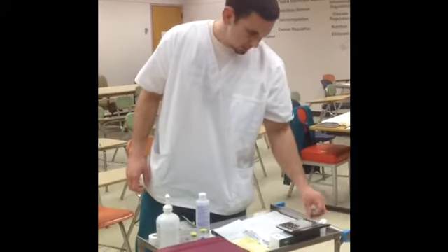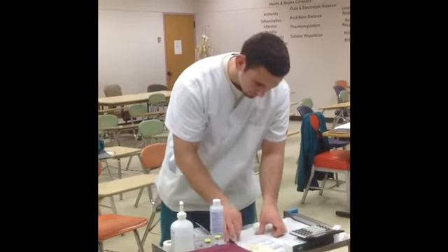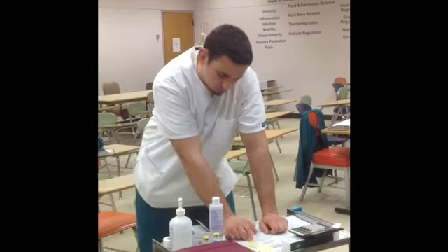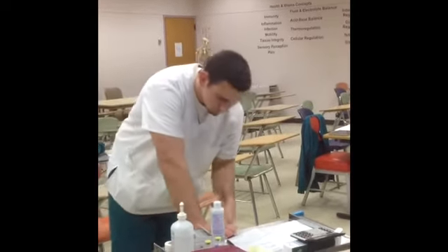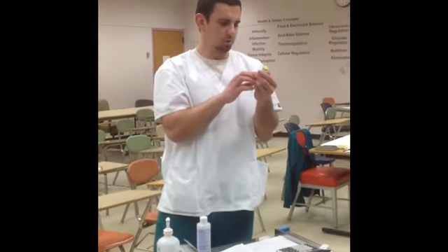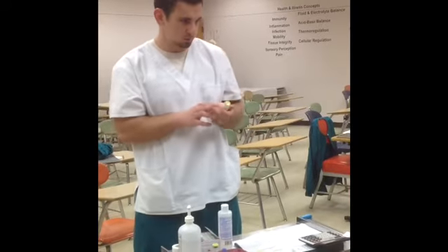Okay, and now I'm going to come to my MAR, or my order sheet actually, and see what I need. So the order calls for Bacillin, 2.4 million units, IM. So I'm going to look in the drawer. I'm going to open it. I'm going to look for Bacillin. Found Bacillin. So our hospital carries it in 2 million units. So yeah, the order calls for 2.4 million units. We have 2 million units.